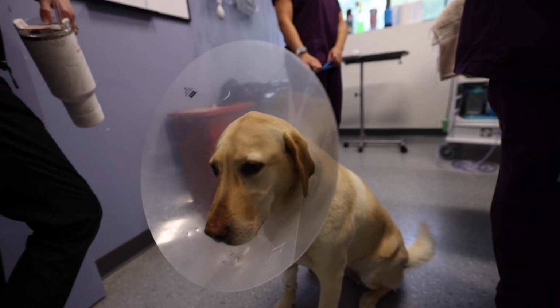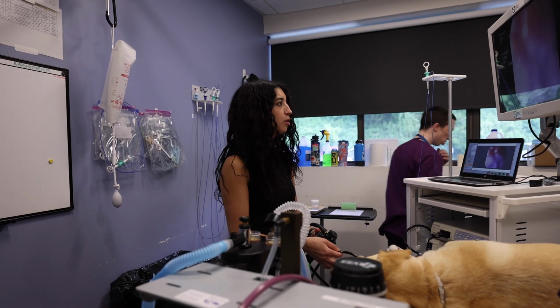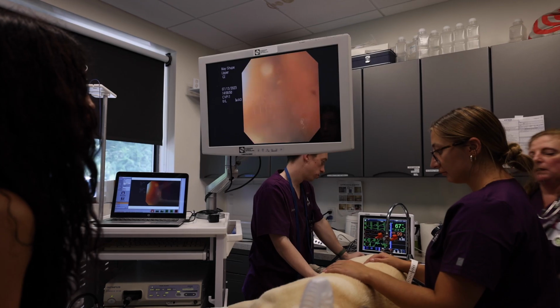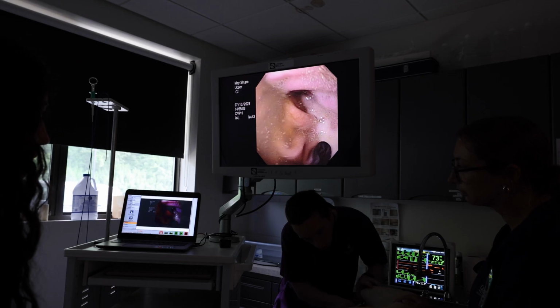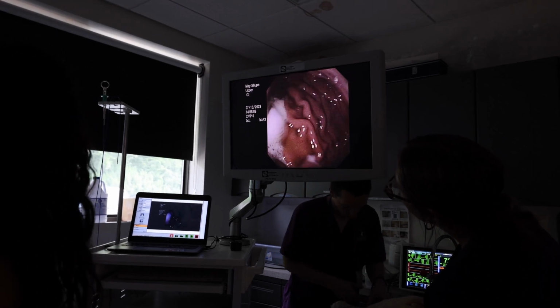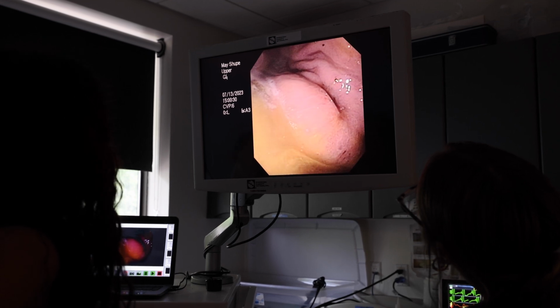So this is a young dog that came in for lethargy and just seeming off with a decreased appetite. She has a longer history of having copper storage hepatopathy, which is basically a disease that her breed of dog is predisposed to, where there is a mutation and copper accumulates in the liver inappropriately. She's been on medication for that for years, so I felt like we did a bunch of other non-invasive tests, and the next right step seemed like an upper GI endoscopy for her.